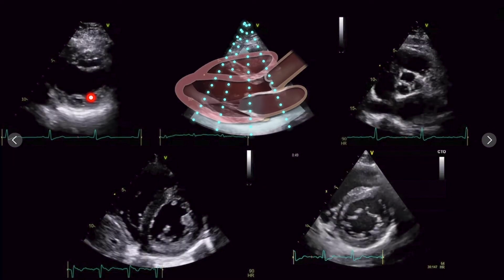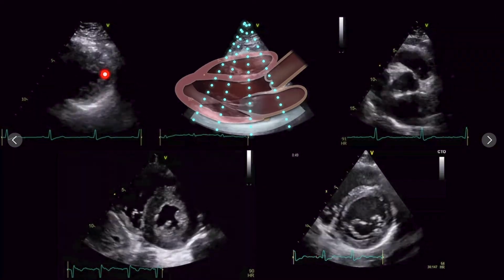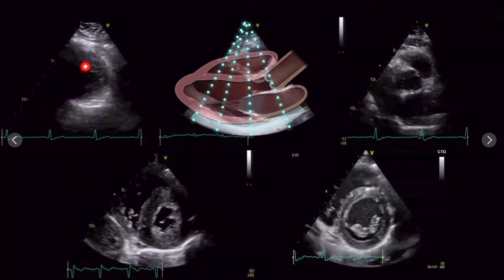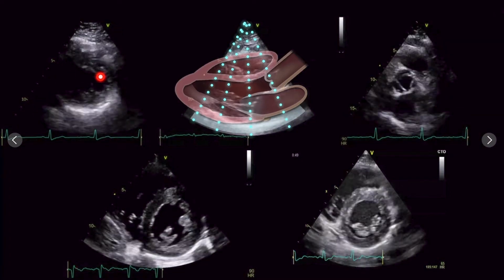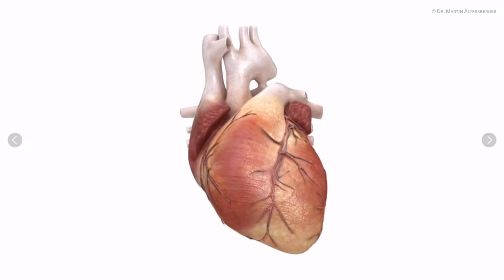Here you can see an example where this is a very important view. You see some hypertrabeculations in the apical region. This is a rare cardiomyopathy. In this view, you can already get a glimpse that the apical region has extended trabeculation, so this spongy appearance.